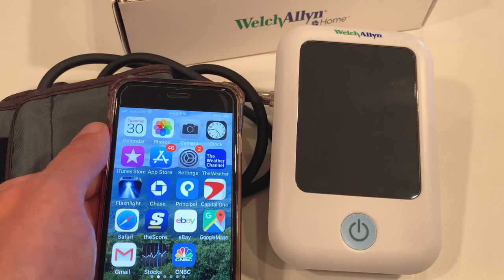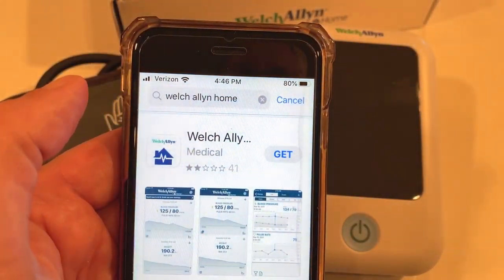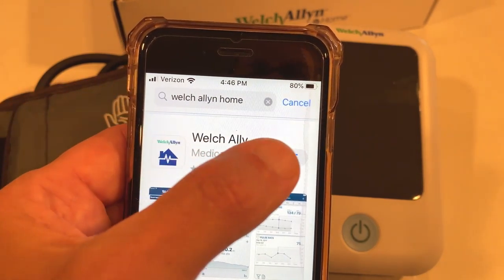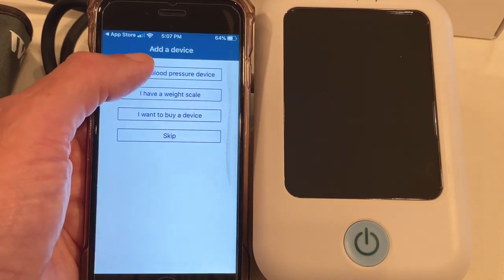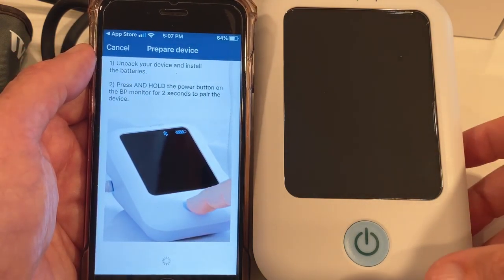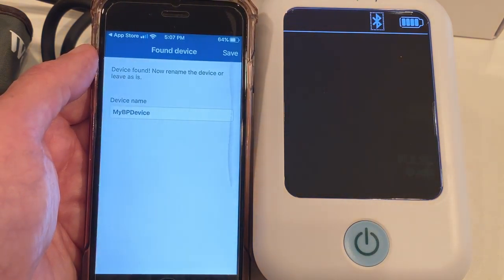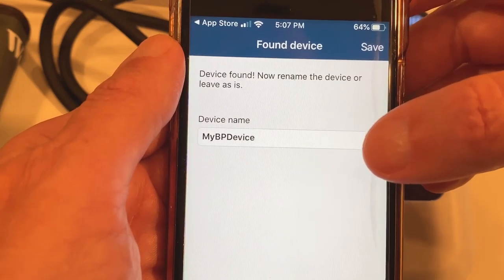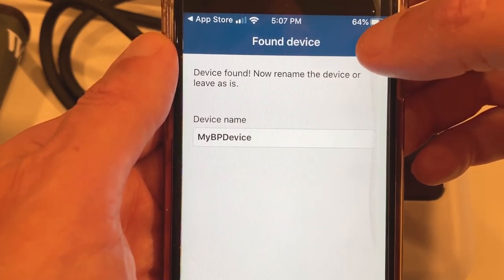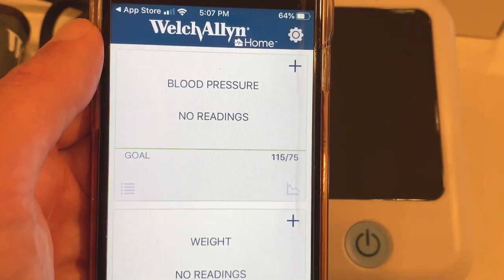The monitor connects to your smartphone by downloading an app where your readings will automatically be transferred and stored. Visit your app store, search for the Welch Allen Home app. Press get and download it to your phone. Once you create your account, choose 'I have a blood pressure device.' Press and hold the power button for two seconds to pair the monitor to your phone. It found my device — press save. It also gives you the option to name your device. I'm going to keep it as 'my blood pressure device.' Choose save, then press done adding devices. It's all connected to my phone.